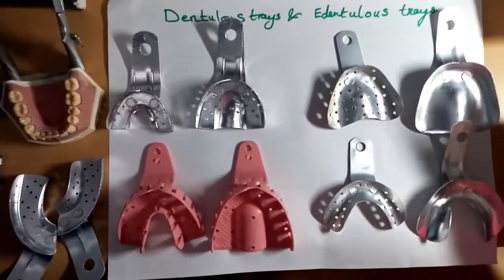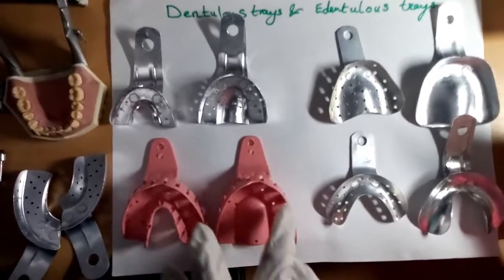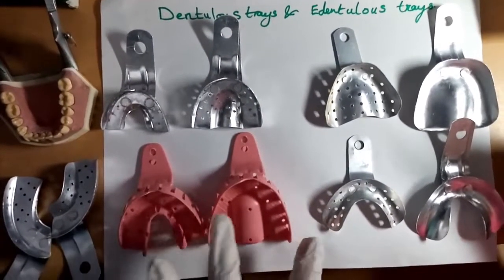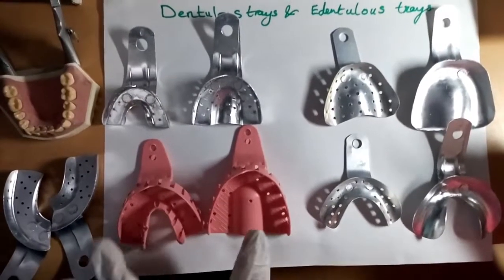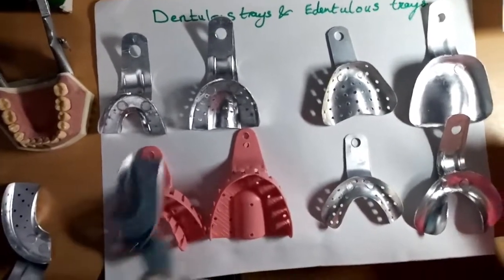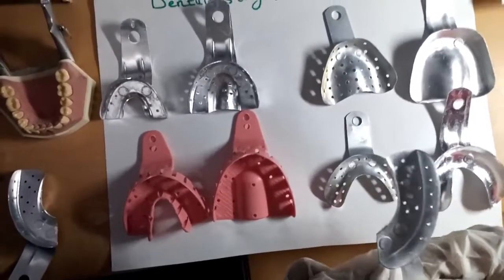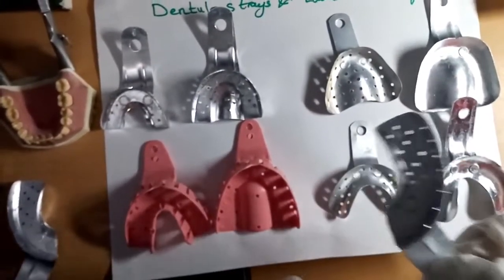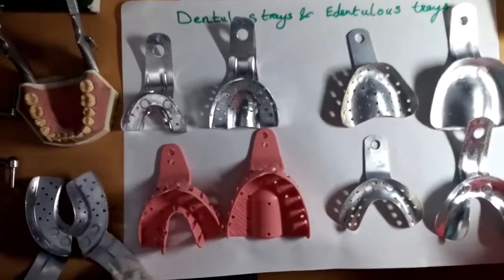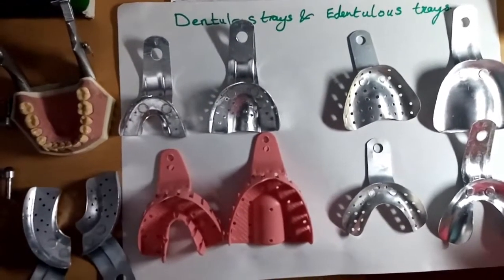Finally, we have another classification, which is full arch and sectional impression trays. Let's see here. This is full arch. Can you see? It takes the whole teeth. We can record the whole upper maxillary or lower teeth. This is called full arch. This is called sectional. If I want part of the teeth to be recorded, this is called sectional impression trays. Can you see the difference? If I have some missing teeth, we use these sectional impression trays.